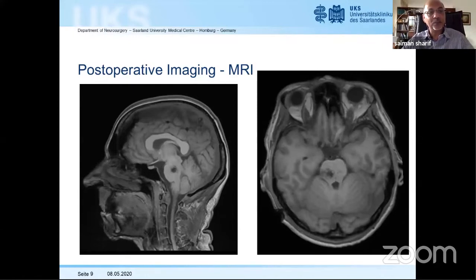Do you think we need to be drilling more in these cases along the mastoid bone to get a better view of the pons? No, I don't think that drilling is important. You have to drain enough CSF, and this case was good because she has some atrophy of the cerebellum.